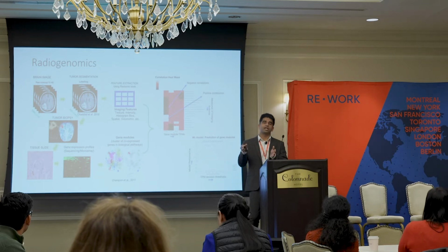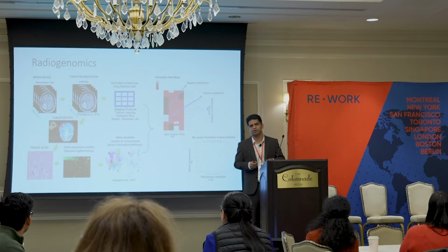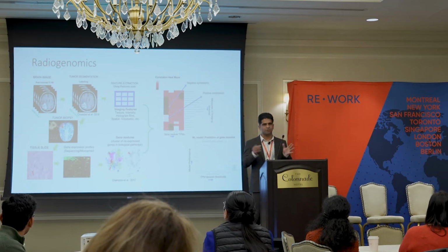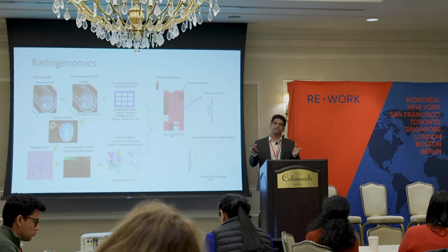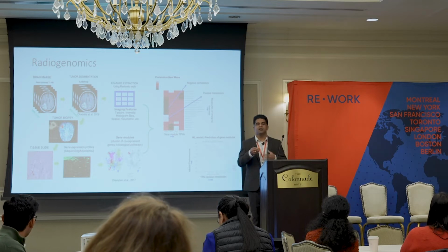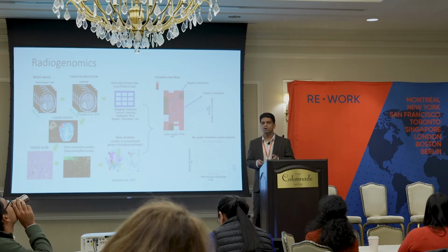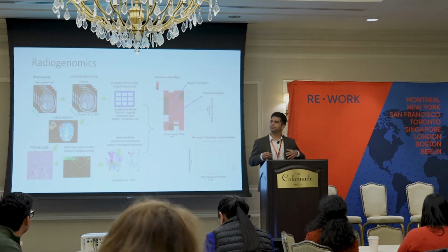Further, moving forward from correlation, ML modeling has been applied, various kinds of models, as Rajesh pointed out, starting with linear regression, decision trees, random forest, the multi-layer neural network on the supervised learning data, etc. And then efforts have been made to predict genomic data from the imaging features or vice versa, right? So that you could define the tumor heterogeneity better, that you don't just go from imaging to gene, but gene to imaging.